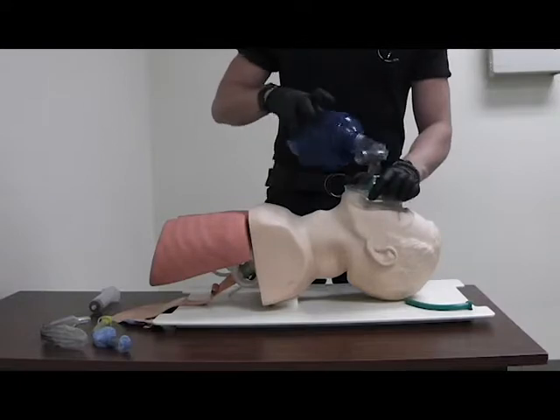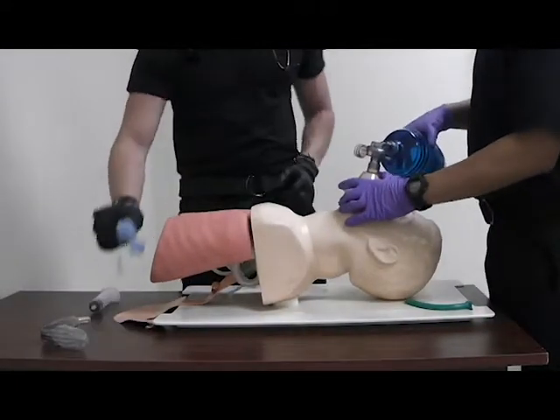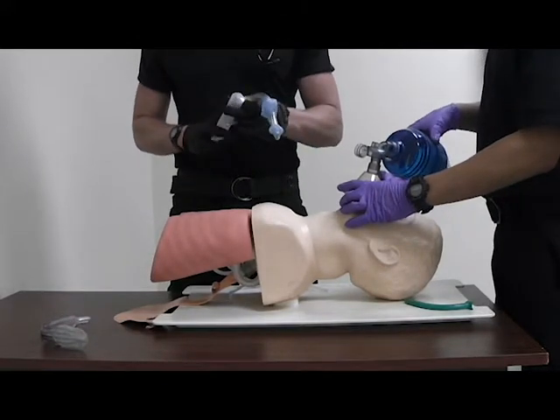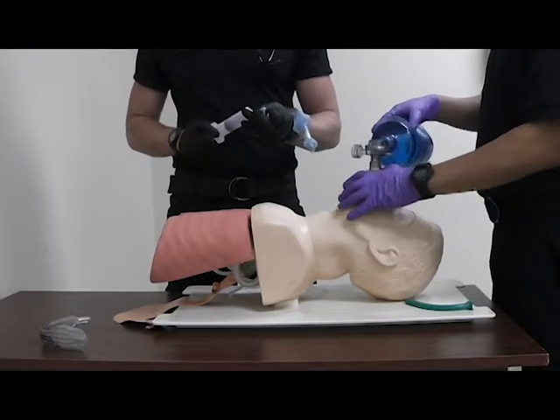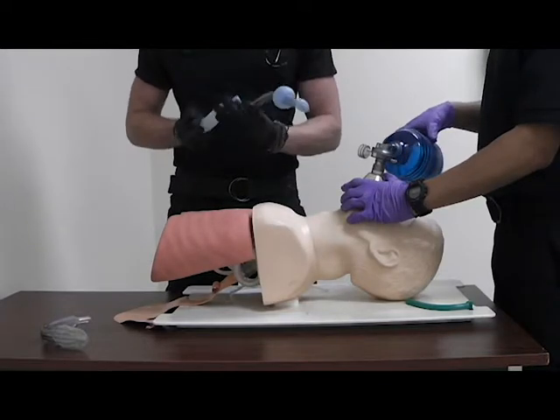At this point I will have my partner take over the bagging while I prep the KING. You want to remove the packaging, make sure it's the right size, and inflate it initially to make sure it has no damage. Looks good.